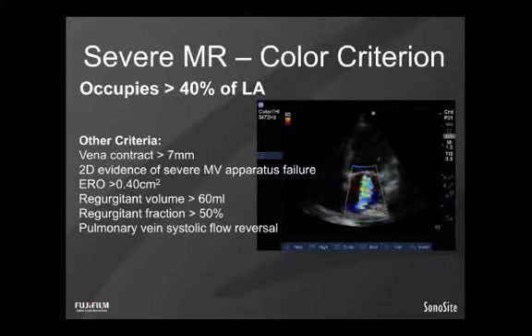in the left atrium. So that is to say, color size is actually a load-dependent situation. So a patient with a low left atrial pressure who has been, say, diuresed for heart failure may show slightly more regurgitation by color criteria than they did when they were volume overloaded with elevated left atrial pressure. So load dependent makes color a little imperfect to make enormous decisions on, but I would say confidently that all point of care and even diagnostic laboratories start with color as their initial screening technique of choice for valves.